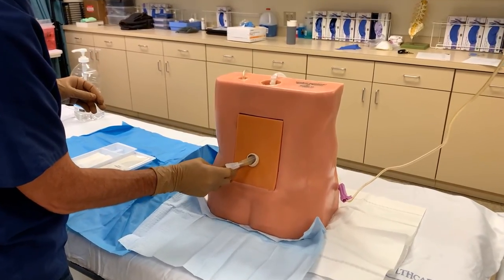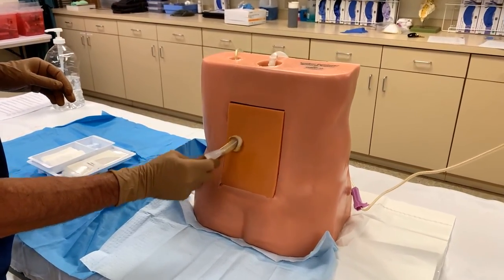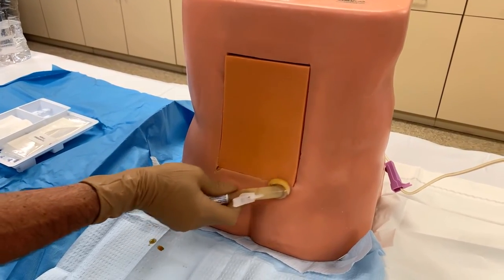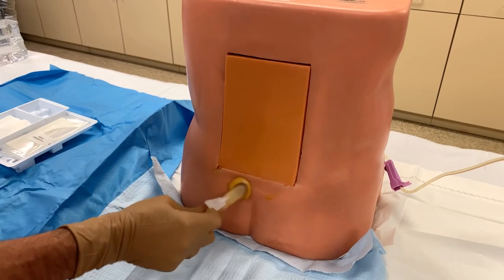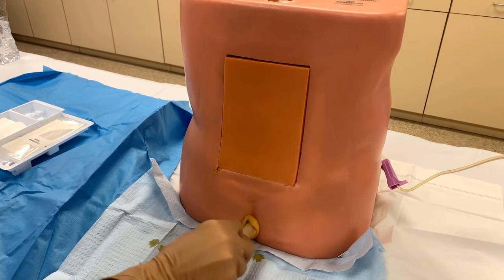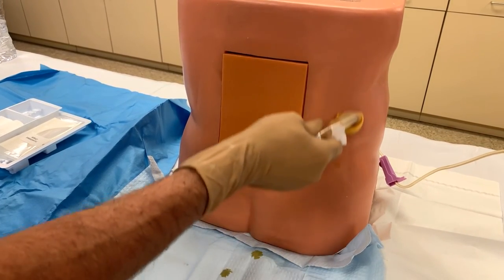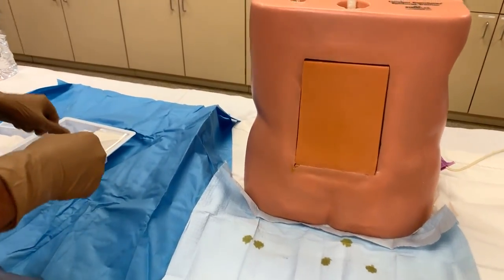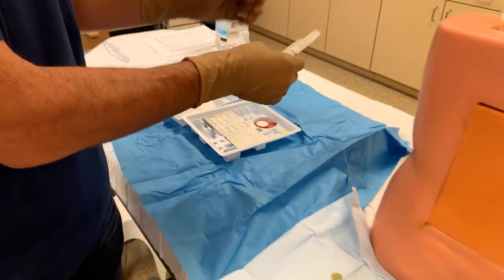Starting at the insertion site, we will move out in concentric circles, never going over the same area twice. We'll go all the way down, and then we can go ahead and place our fenestrated drape.